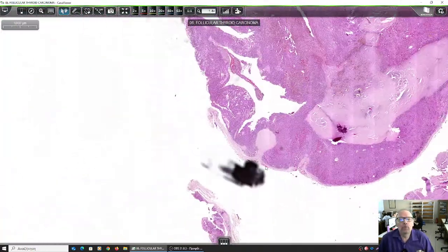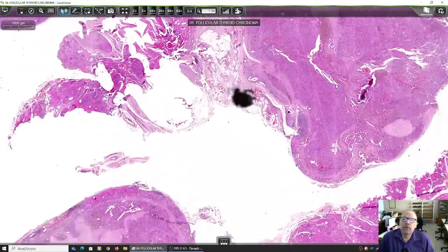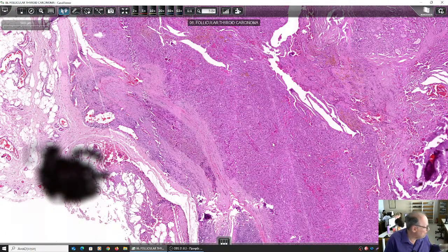So, how will we define this as a follicular cell carcinoma, which is a different kind of cancer than papillary cell carcinoma, more aggressive, because papillary carcinoma gives lymph node metastasis and mainly regional lymph node metastasis. On the contrary, follicular carcinoma may be well differentiated. That means it derives from follicular cells and it looks so.